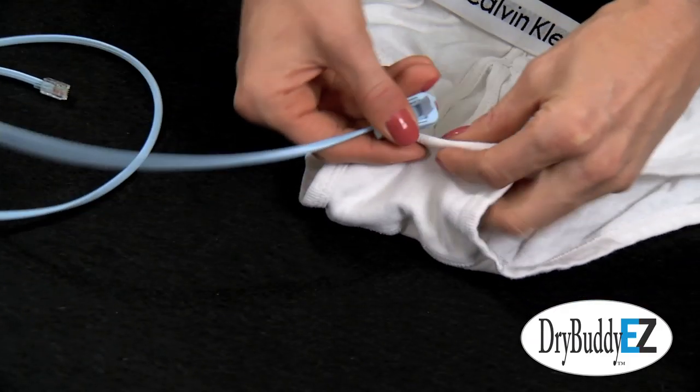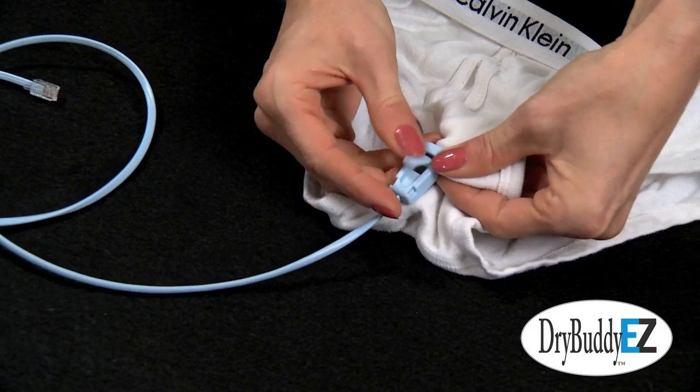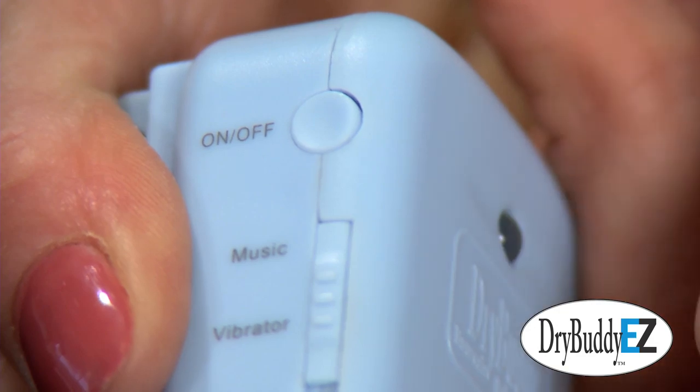Meanwhile I would make sure that David cleaned himself, put on fresh briefs, and then reattached the sensor clip to the briefs. The alarm was now switched on and David would go back to sleep.